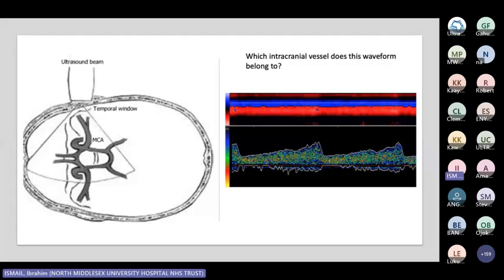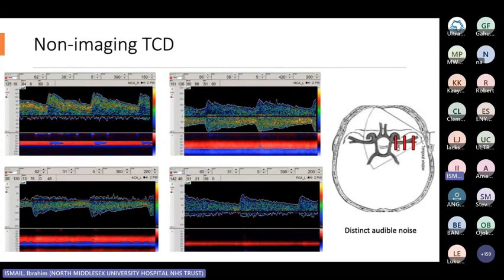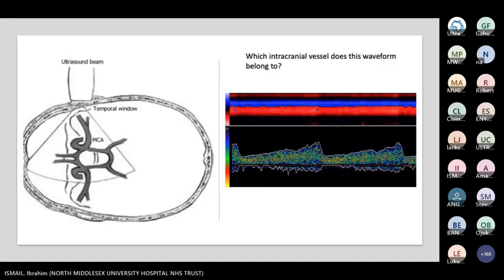Oh, so they changed now, right? Now they switched, yes. Let's learn. Fair enough. So 8% thought it was ACA, 70% thought it was the MCA, and 22% thought it was the PCA. Just having a look at the images here, you look at the MCA itself, and then just look at this MCA. There are key differences, aren't there?